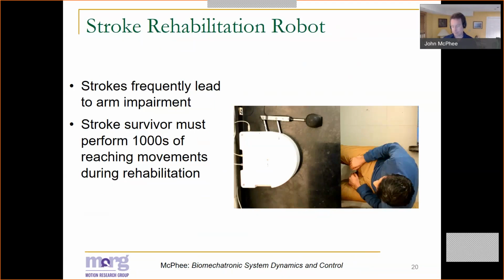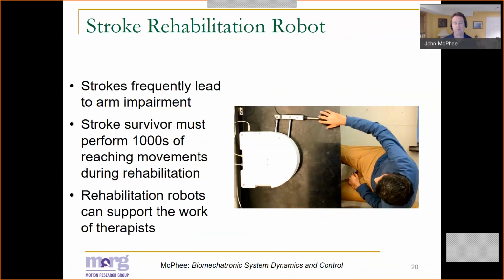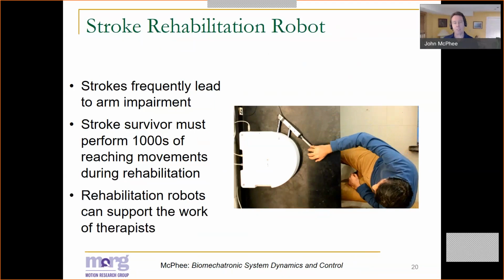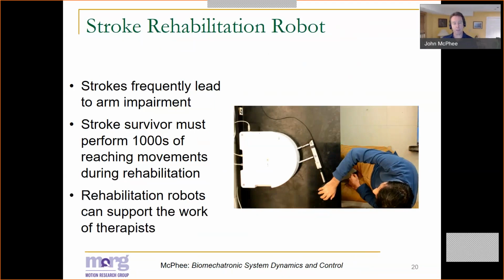And so it seems like the rehabilitation robot that's shown here in our lab can support the work of a physiotherapist or an occupational therapist. What we envision is, instead of one therapist working with each patient, perhaps we have one robot with each patient, providing quantitative feedback to the patient, not just qualitative. And these robot-patient pairs are being supervised and supported by a smaller number of therapists.